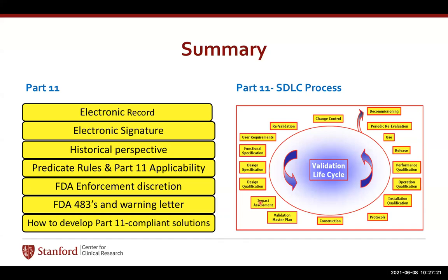And then we have risk assessment here with the clinical research that I worked on to come up with, which is called STRACT, that we can use to do the risk assessment for the clinical trials that we are doing. Then we have to write validation master plan before doing anything, and then start making the device, write the protocol, then do all the things that I mentioned, then release it, and then use it. After that, maintain it. There will be quite a few release notes on that. Then it will be under control.